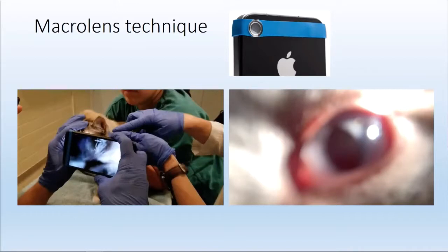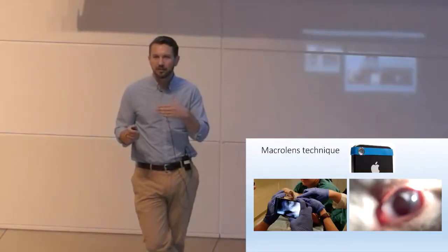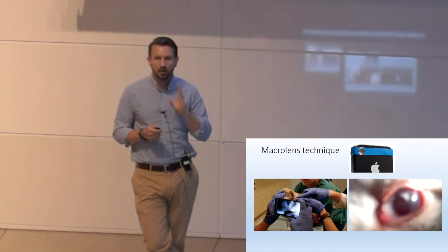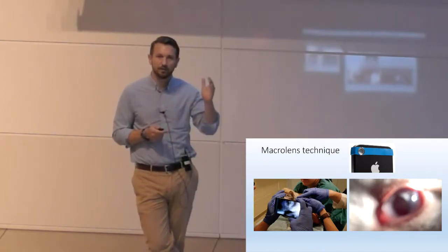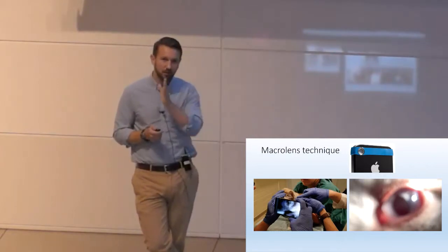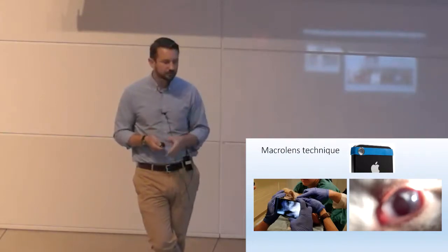So you see the macro lens wrapped around the camera. A lot of you would be asking what happens with double and even triple lenses coming out with smartphones nowadays. I know iPhone's the best because I use them. It is the most peripheral camera, the camera lens that is closest to the corner of the phone. So that would be the top one on the iPhone 10, or the one more peripheral on the iPhone 6 Plus, 7 Plus or 8 Plus.